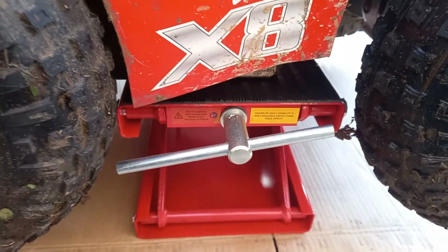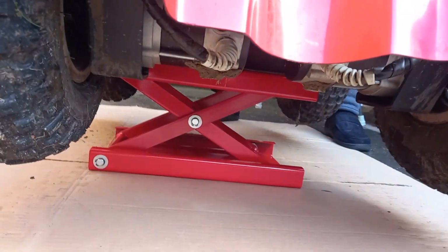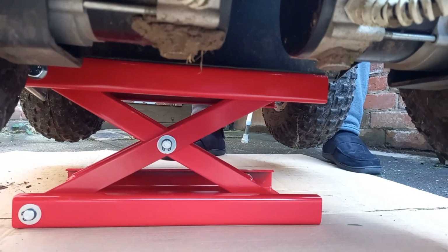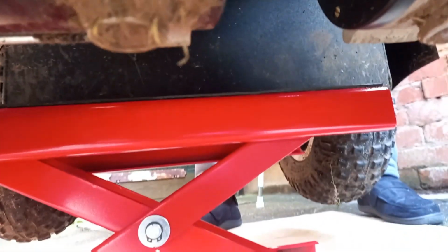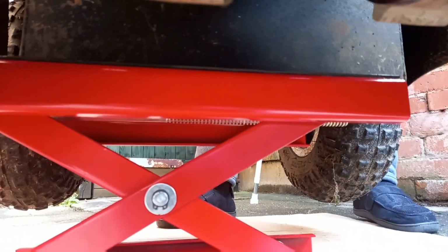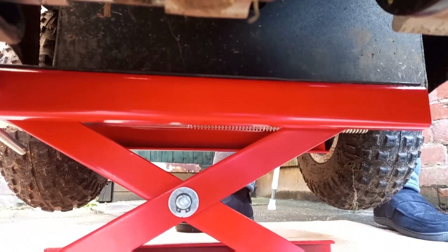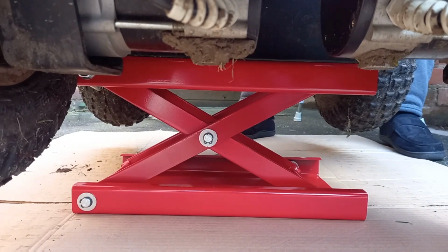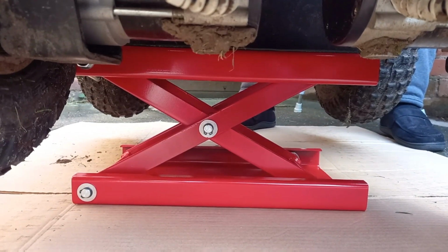Yeah, so it's a bit wobbly, but that isn't actually wobbly on the stand. I think it's the actual stand. That's actually the stand flexing. So that's how we've got it. Which is odd, because that stand's meant to take 450 kilos. It's actually on the battery box, if you can see, which is really strong. Ideally it could have come this way a bit more, but you want to be able to wind the handle on the thingy bob, you see. So that's let us down slightly, because the stand hasn't got a hexagon.